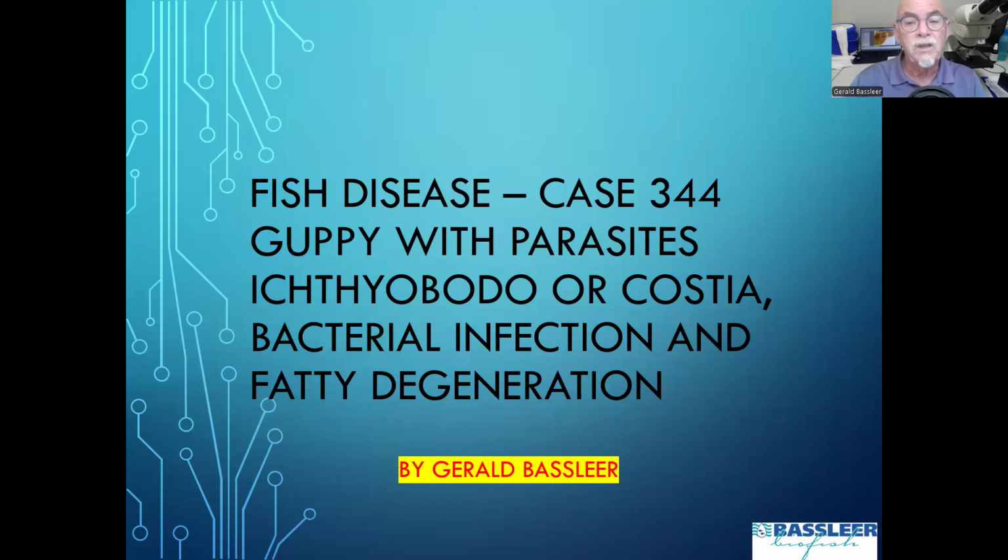On a guppy that I examined during my work as a fish doctor. I show you my findings of the fish in the aquarium and my microscopic observations, and I will give you some advice about treatments. So let me share my PowerPoint that might help you to understand this case of fish disease of a guppy with parasites Ichthyobodo, used to be called Costia, a bacterial infection, and fatty degeneration.